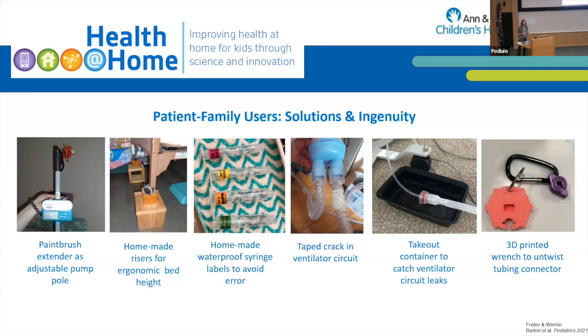I love to point out this last one because we see a lot of family engineers, and we'll have another one talking with us soon here in our next panel, making really incredible fixes for a lot of these issues. So there's a parent on Etsy who's selling a 3D printer wrench to help for the ways in which a feeding pump is not connecting very well, and families are having to use their teeth to open it.